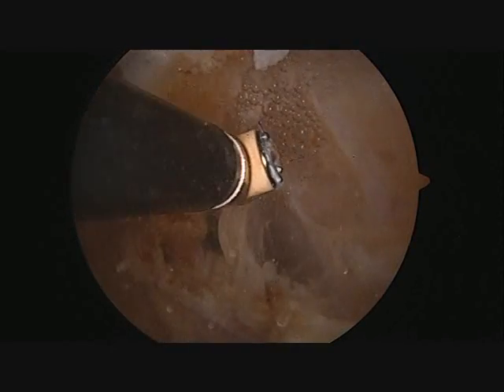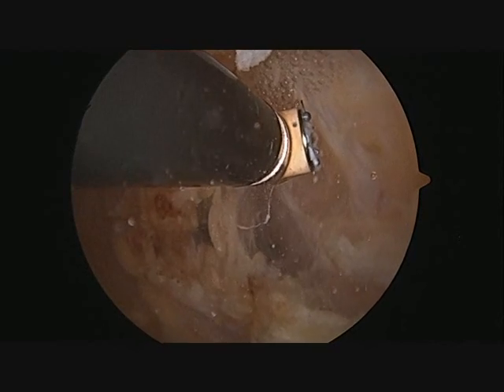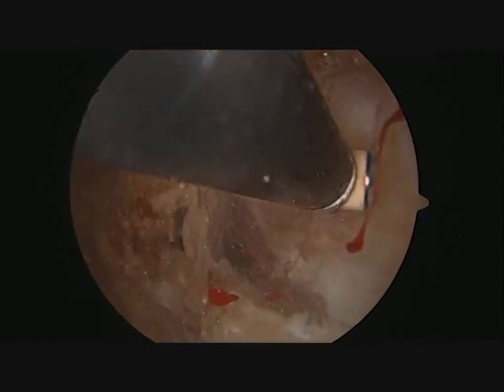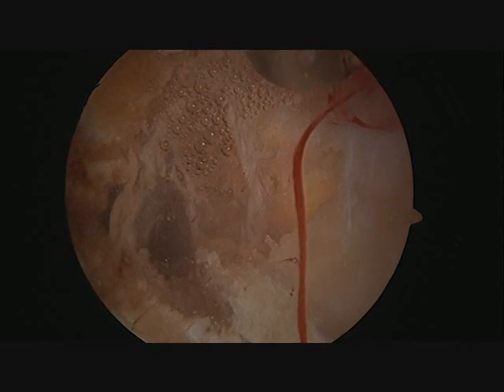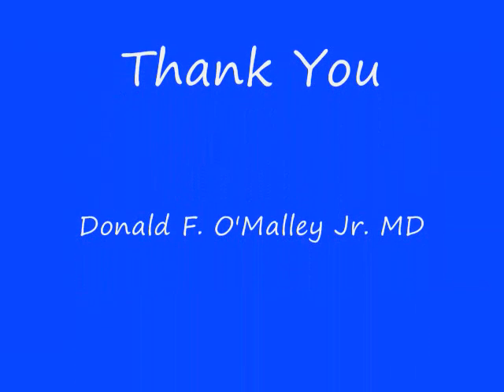Because this tissue has a very large blood supply and bleeding is a significant complication, I release the tourniquet and identify any large bleeders. One bleeder here is clearly seen and the bleeding can be stopped with the wand. Once I am satisfied that I have completed the release and thoroughly examined the knee, I remove the arthroscope and the patient is started on the road to recovery with an aggressive physical therapy program.